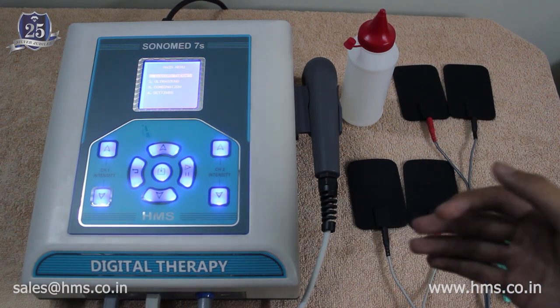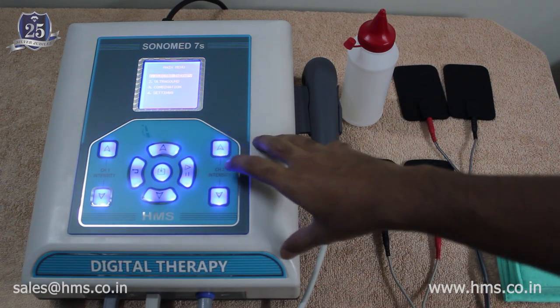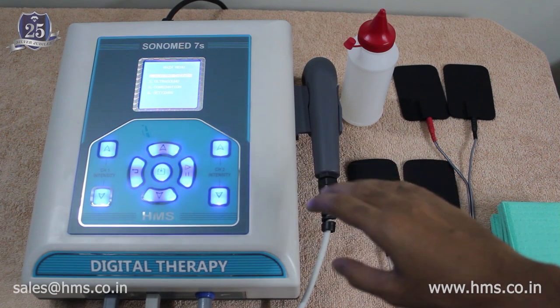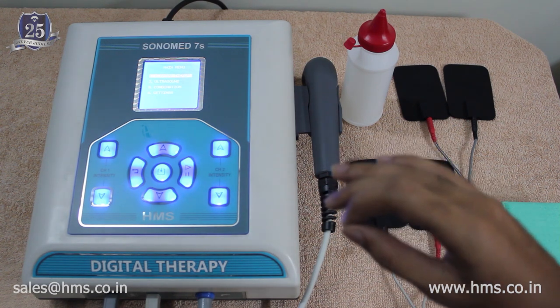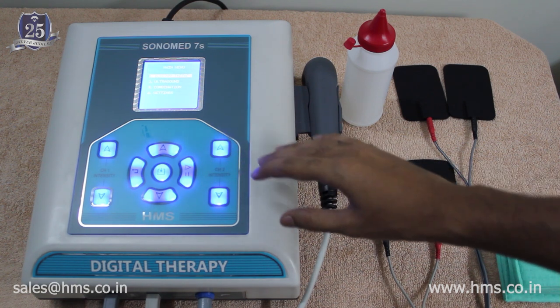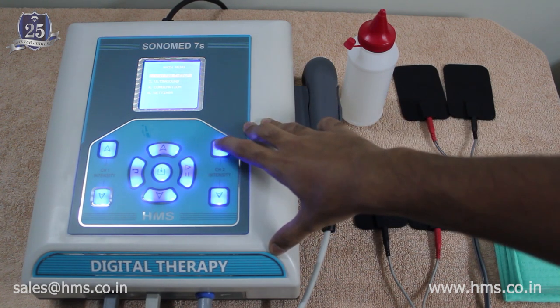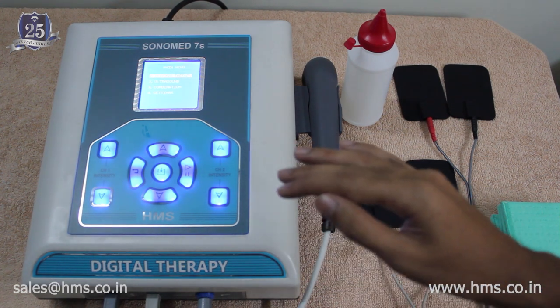In four-pole IFT mode, increasing the intensity using either the channel 1 or channel 2 switch raises the intensity equally on both channels simultaneously. In two-pole modes, the channel intensity increases separately — increasing channel 2 intensity only affects channel 2, while channel 1 remains unchanged.